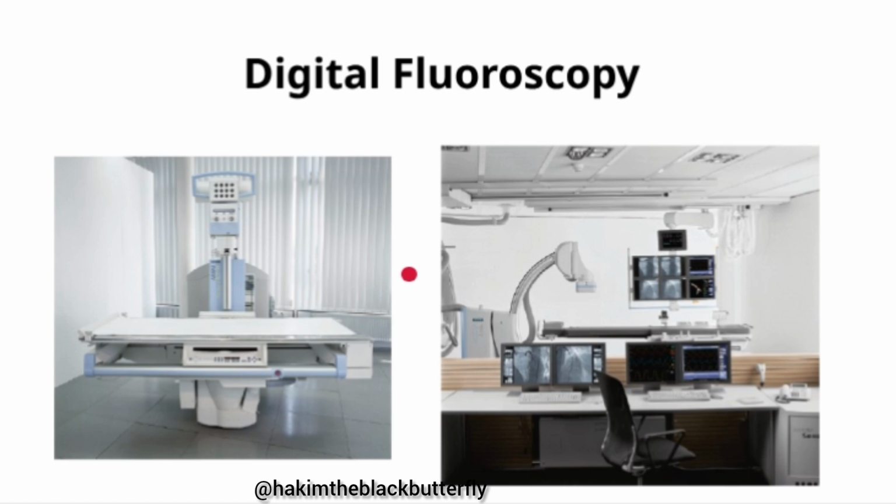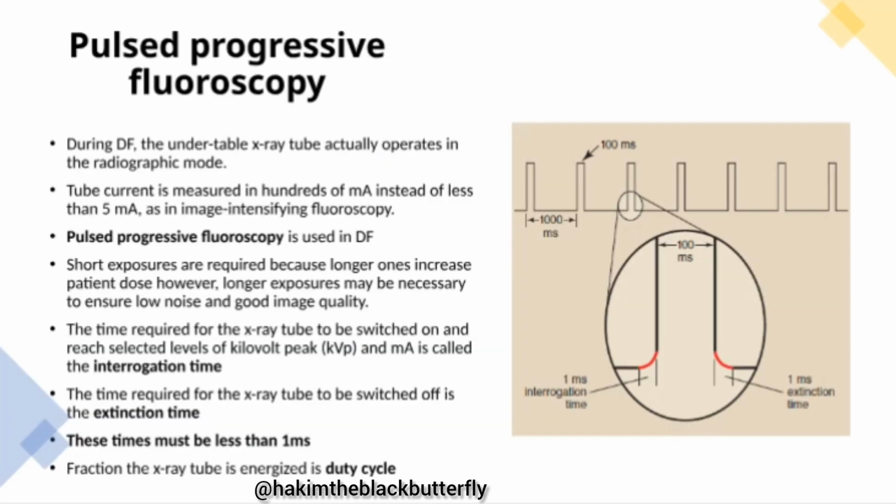One, we said that most of the digital equipment is really sensitive. Okay, when we say sensitivity, it means that they even pick up the lowest dose, which is not the case in conventional modes. So you get to see that the appearance of the conversion fluoroscopic equipment and the digital fluoroscopic equipment makes the biggest difference between these two.